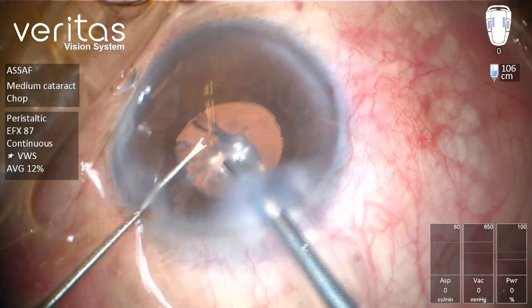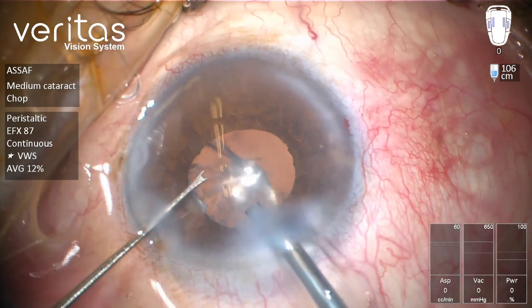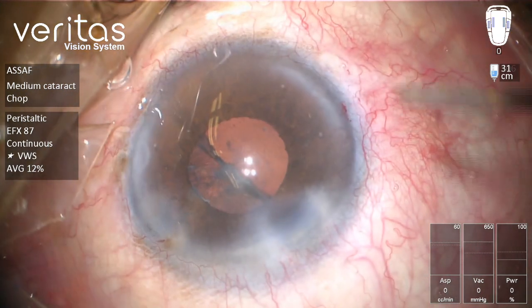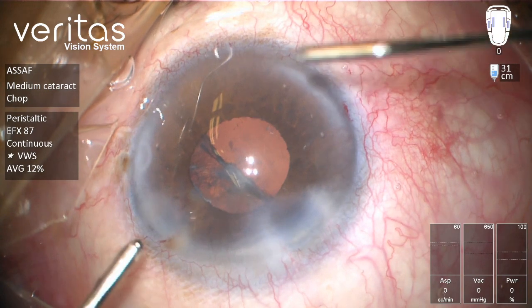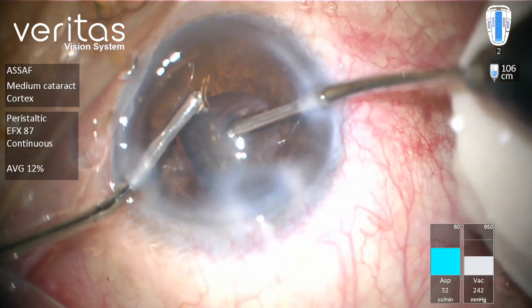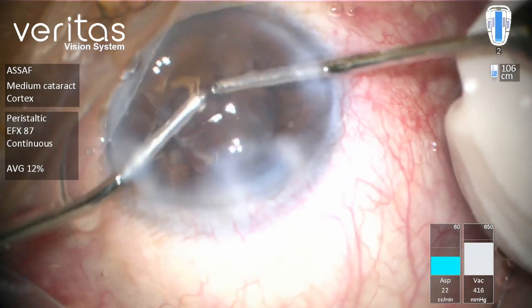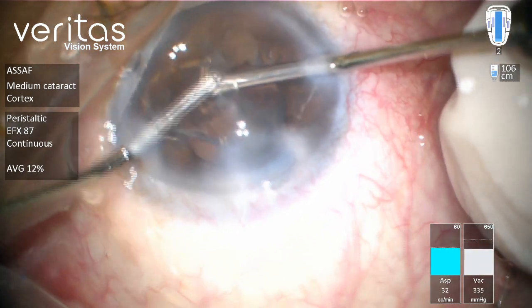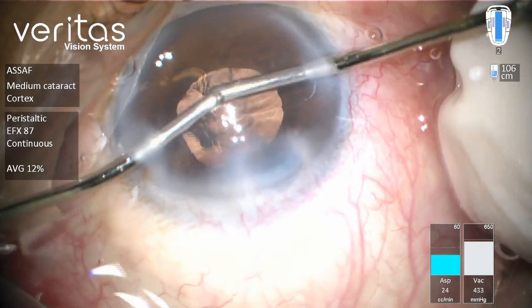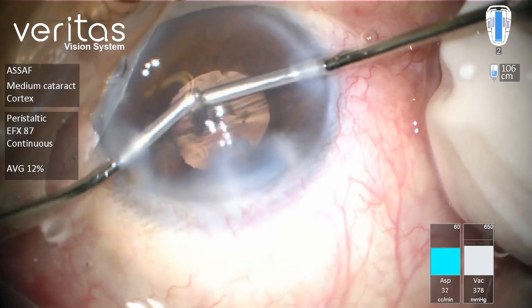We now have a small part of epinucleus remaining, which we can address by irrigation and aspiration. The pupil is around 4 millimeters in diameter. The epinucleus is semi-solid, so we can crush those fibers with the second instrument and patiently aspirate those parts.